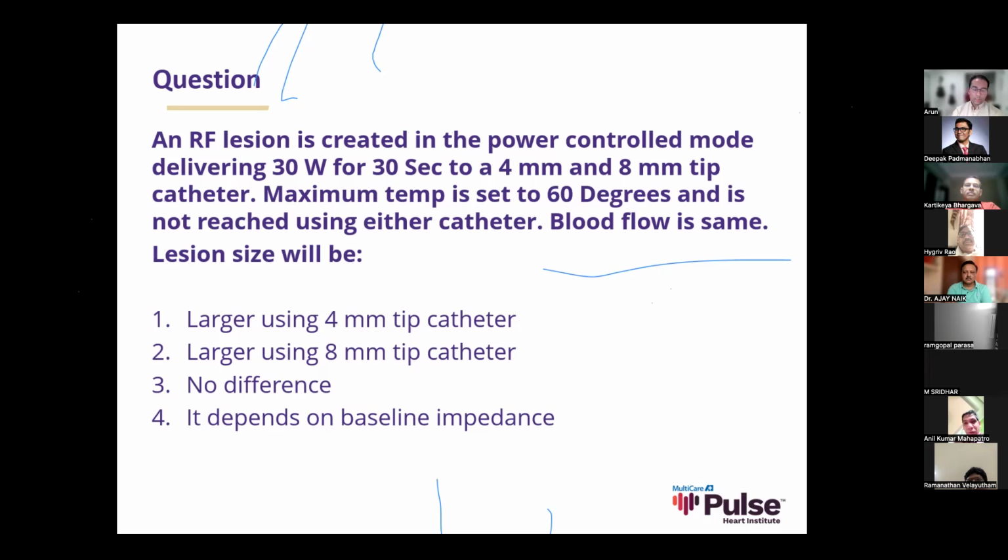It's a very, very interesting question actually. It becomes important in two different scenarios. As was correctly mentioned, when you are ablating in a pouch, the impedance can be high. When you're ablating in the coronary sinus, the impedance can be high. You want to have an impedance of around 100 to 110, or around 120. Anything beyond that leads to ineffective delivery of joules into the tissue. It becomes too high an impedance. I don't know if it is actually harmful or not, but I've never tried to ablate in a scenario where my impedance is greater than 150. I've never experimented with it.